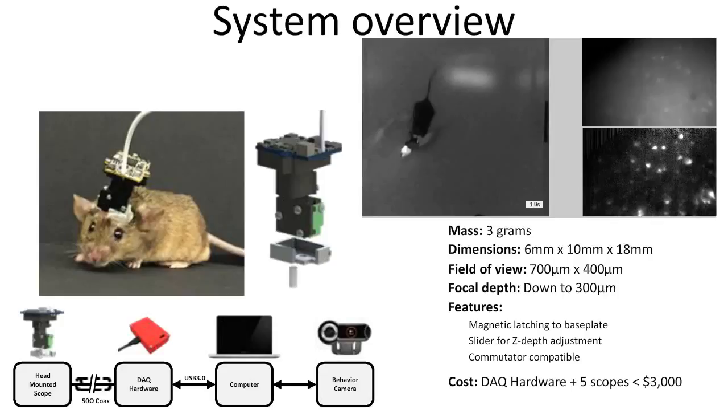Here you can see the raw images that we record, and the delta F over F images that we've also been recording, and you can see that the signal to noise ratios are quite high. It's almost as good as two-photon microscopy in this example. And so this is a large group of CA1 neurons, several hundred CA1 neurons that we imaged while this animal was walking around.